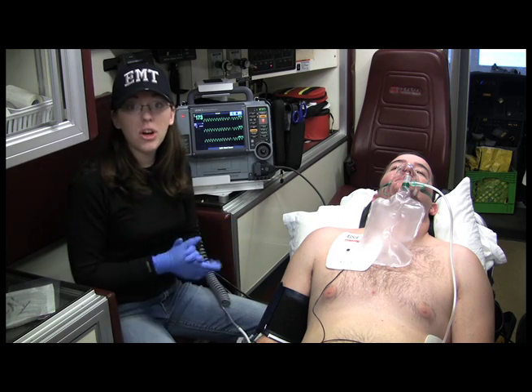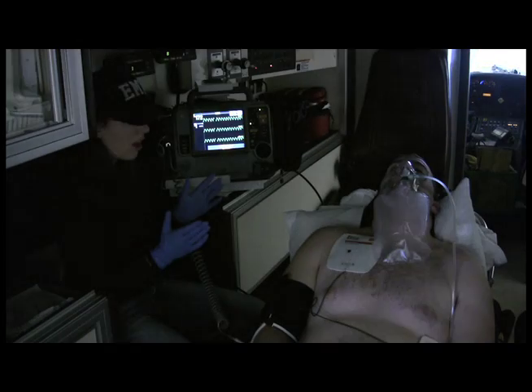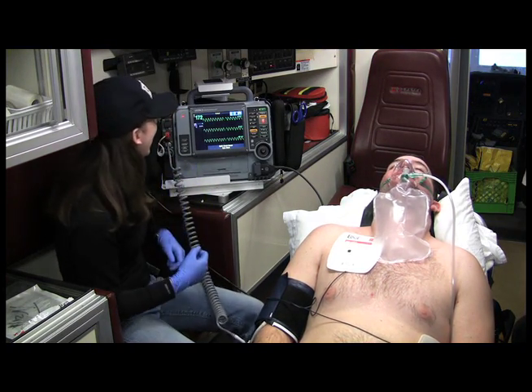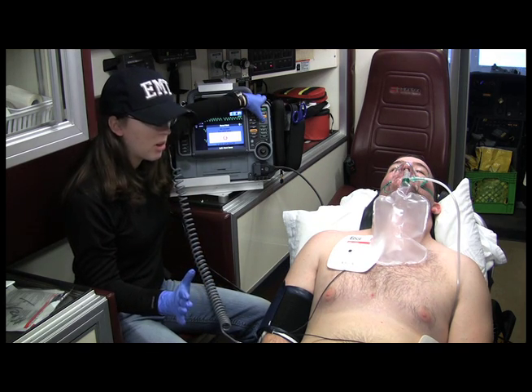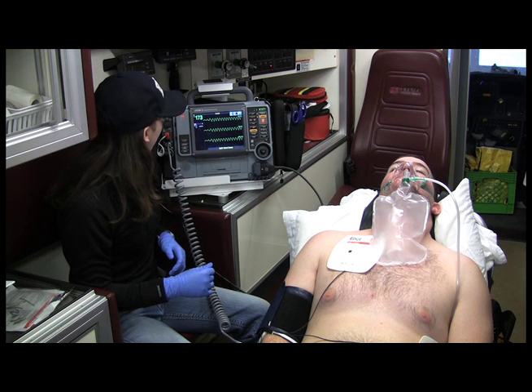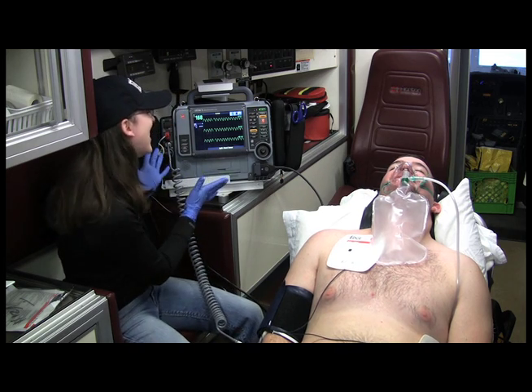So we're all set to go — if I got medication for this patient... [Outtake: instructor makes an error mid-sentence and laughs.] I am shocking, holding down the button. I hear it click. And now we are seeing... normal sinus rhythm!